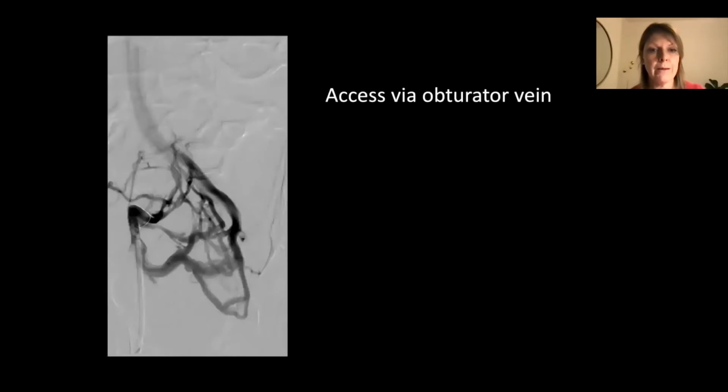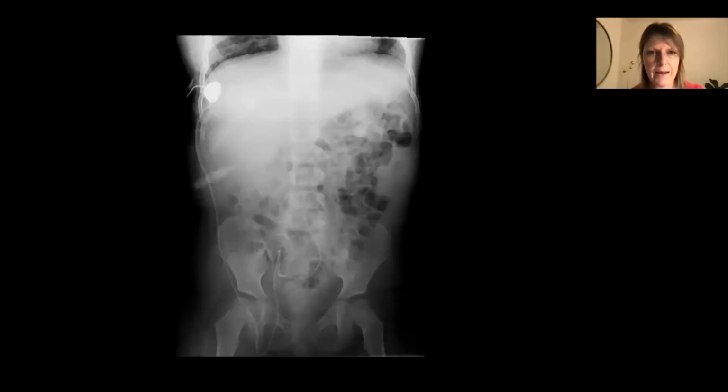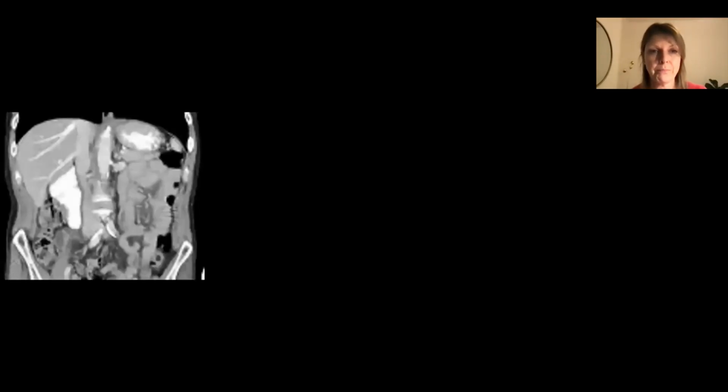This one was a bit more challenging. This is from the groin. These are the obturator veins because the common femoral veins had gone. And I think you can just make out the details of the pathway of this port catheter here. We've placed the port reservoir up on the chest wall as per normal, but this really long catheter has been tunneled all the way down the chest wall to the groin. And then through all of those collaterals, the obturator veins, across onto the other side of the pelvis, into the left internal iliac vein, and up towards the right atrium. But this catheter stayed in for many years, and this child did really well.